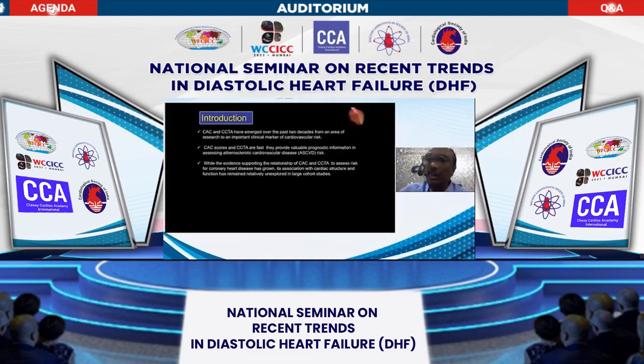It is a good place to start when you are picking up minimal plaques or mild disease. It is a good practice, I think, in the future with the advent of good CTs, MRI and echo, to always have a look at the cardiac function also in terms of the quantification of the strain, the stress pattern, the myocardial swirling, which we can see in the new generation 4D MRIs.